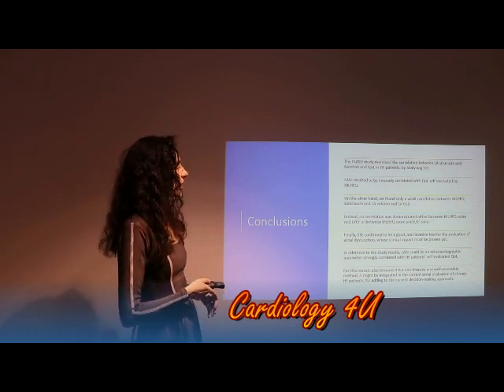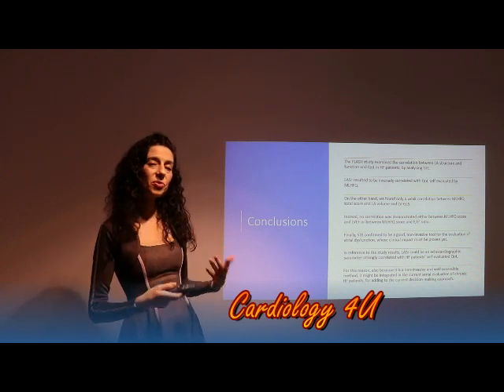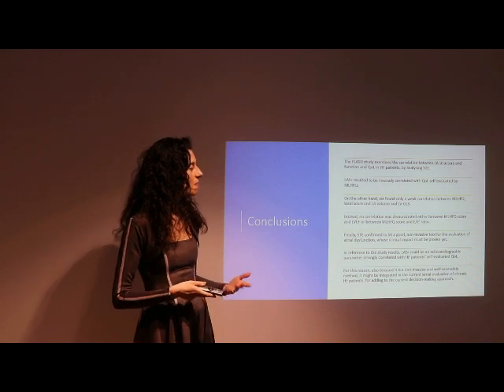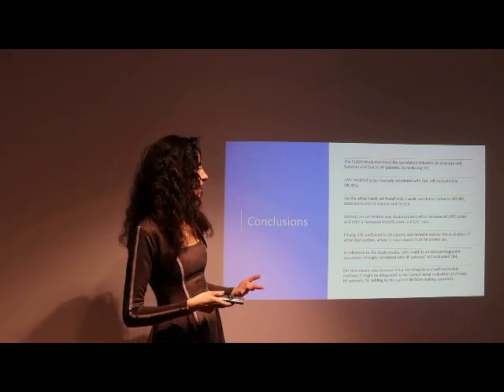Finally, speckle tracking echo confirmed to be a good non-invasive tool for the evaluation of atrial dysfunction, whose clinical impact must be proven yet.